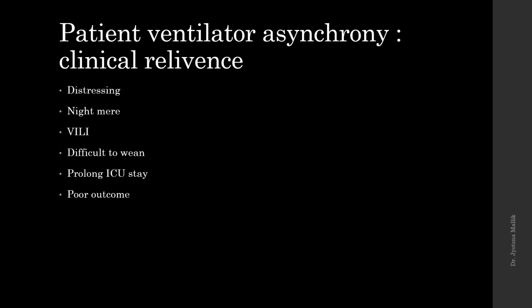And why are we putting the patient on a ventilator? To support the breathing, to support the patient. So we need to synchronize the ventilator to work according to the patient's needs, and if that doesn't happen, that is asynchrony. And what is its relevance? The patient will be in distress, it will be a nightmare for the patient, there will be ventilator-induced lung injury, it will be difficult to wean the patient, there will be prolonged ICU stay, and there will be poor outcome.